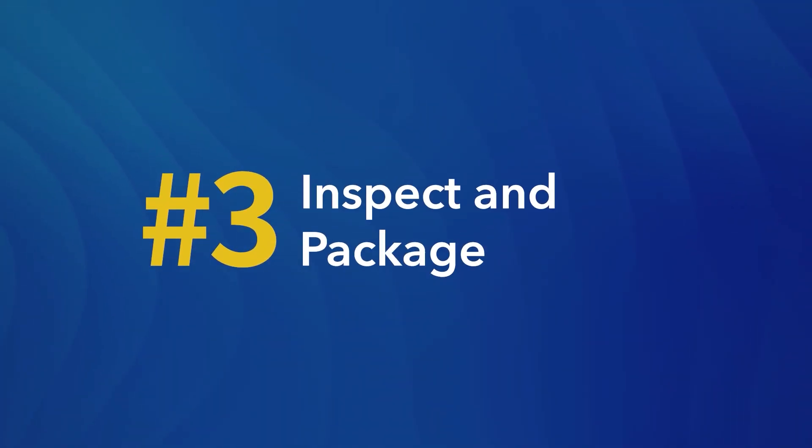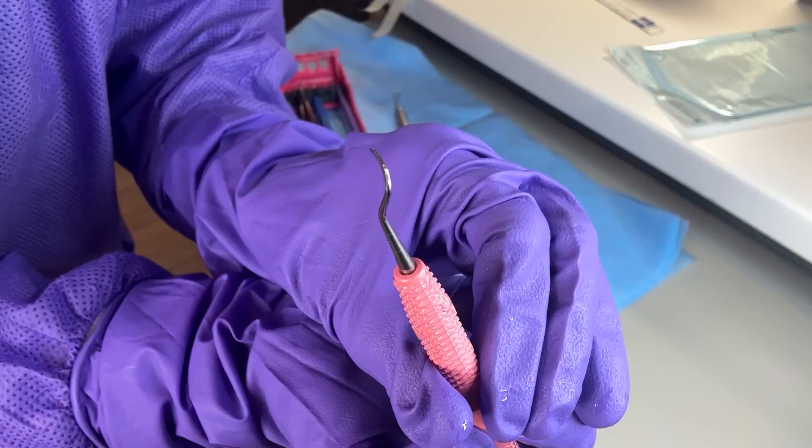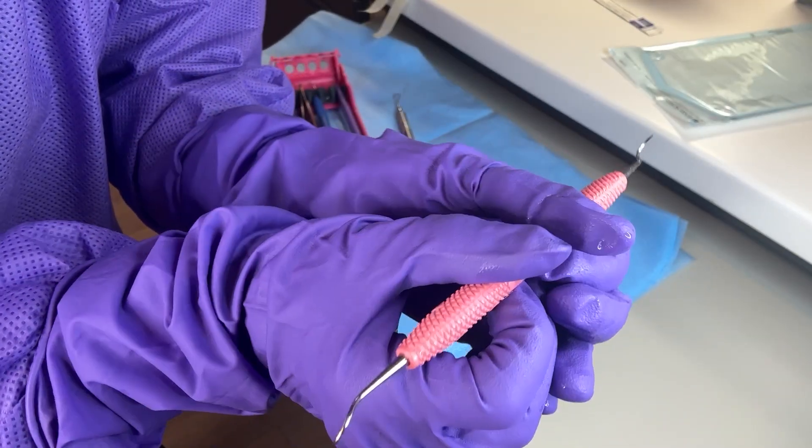Number three: inspect and package. During the inspection step, carefully examine each instrument for any signs of damage, wear, or remaining debris. Instruments with visible damage or persistent contamination should be removed from service and either repaired or disposed of appropriately.